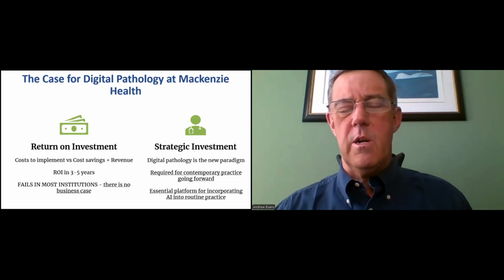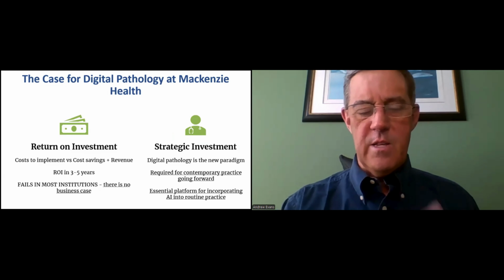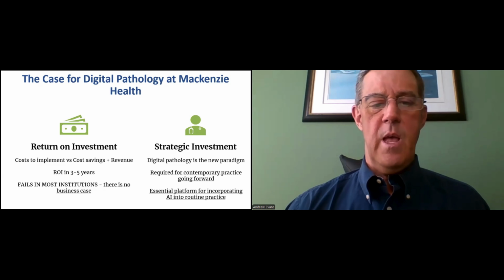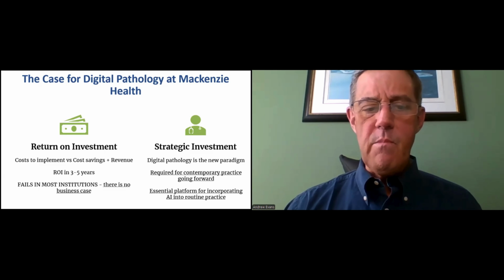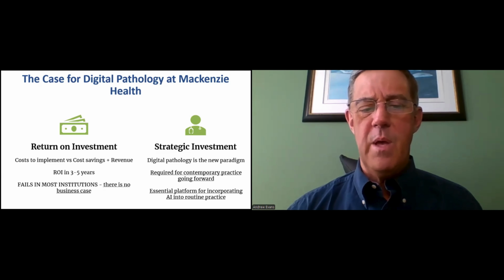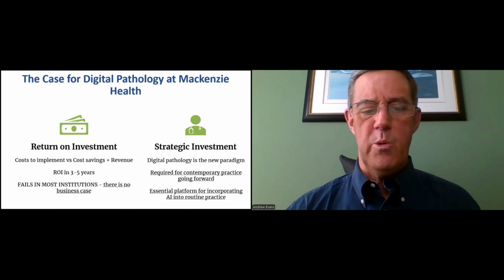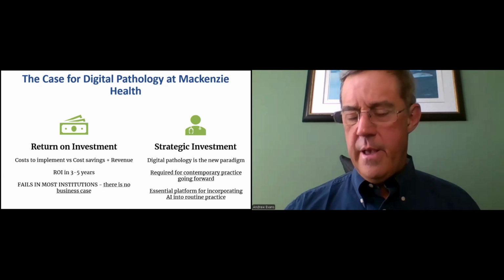The case for going digital at Mackenzie Health, I think it's a unique situation in that as opposed to approaching this from a return on investment perspective, where you look at the cost to implement, how much revenue you might generate, how much money you might save, and looking for a return on investment in 3 to 5 years. If you just take this very narrow focus within the four walls of a lab, this particular return on investment strategy is going to fail as a business case in most institutions. You come to the conclusion there is no business case, it's just more cost.